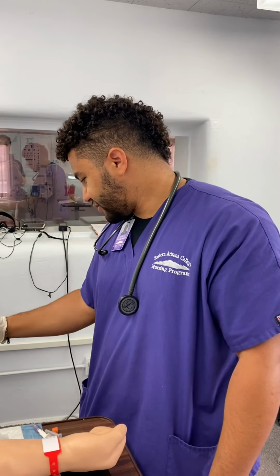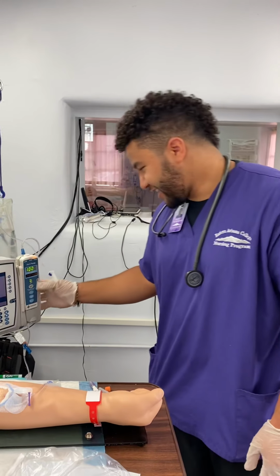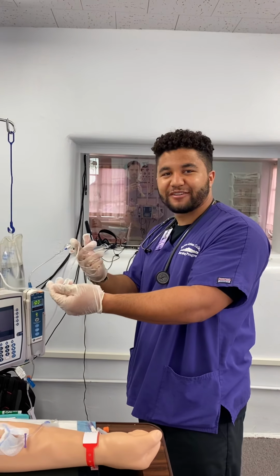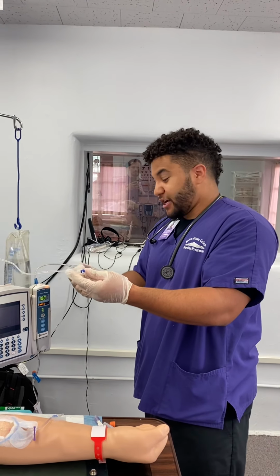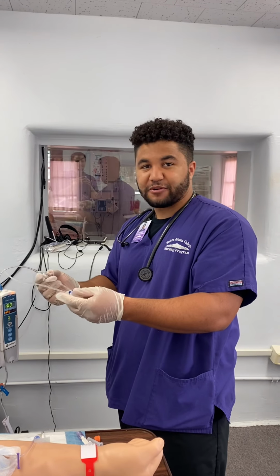Looks like we almost fixed the problem. So I don't know. You want to go ahead and hit, just, I don't know, it's like crazy bubbly. I don't know what happened. It's reused. That is probably it. It is reused. Is it still recording?